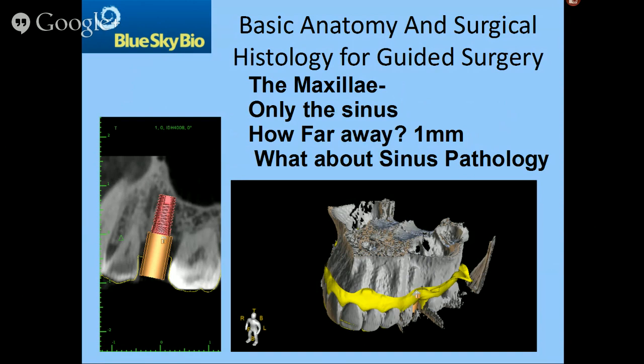But again, the point of this conversation is not to tell you all the things of sinus anatomy, sinus pathology. After all, we're guiding not to enter the sinus. So unlike the other areas where I said to you 2 millimeters, I think you can go up to the sinus without a problem. Personally, I have no problem extending 1 millimeter into a sinus. Usually when I do, I end up trying to do a little bit of a lift, but that's a whole different story. That's my thing. But if you wanted to stay away, as somebody who makes guides, about 1 millimeter, that's okay also.